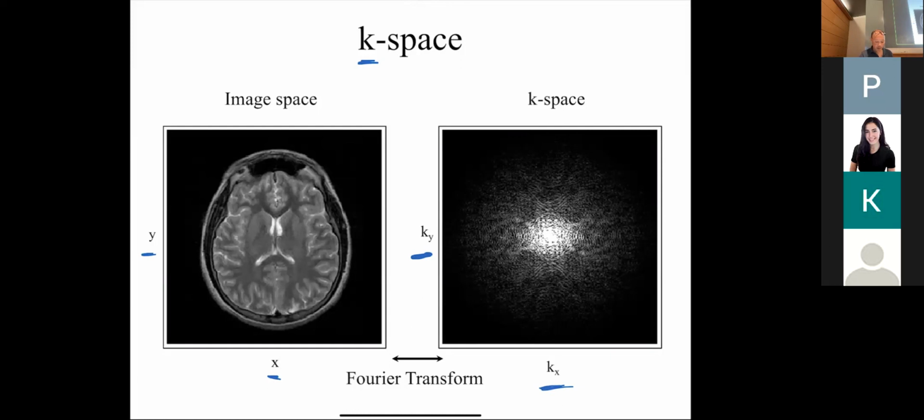You can see here, for this object and almost any biological object, that the Fourier transform is pretty big at the center. The brightness here indicates how big the Fourier coefficient is. So as you see, it's pretty strong at the center, and then it falls off as we go out to higher values of K-space. Okay.